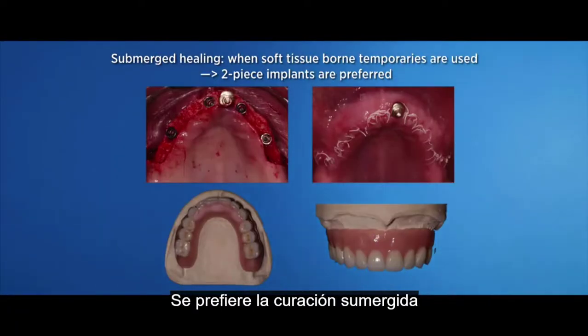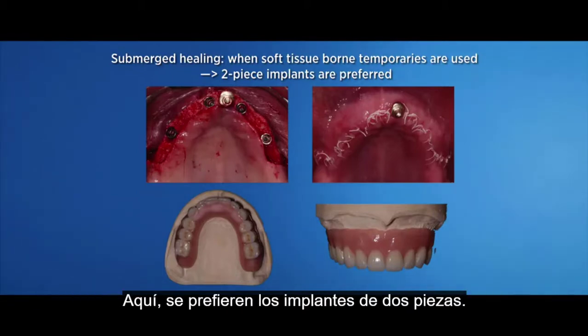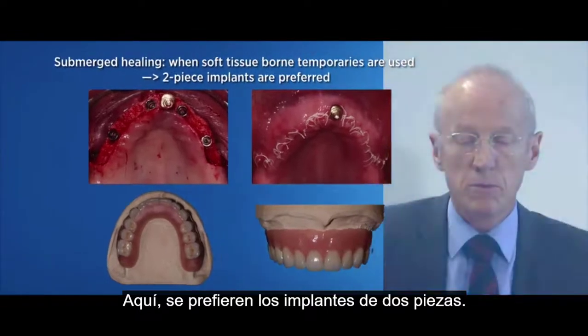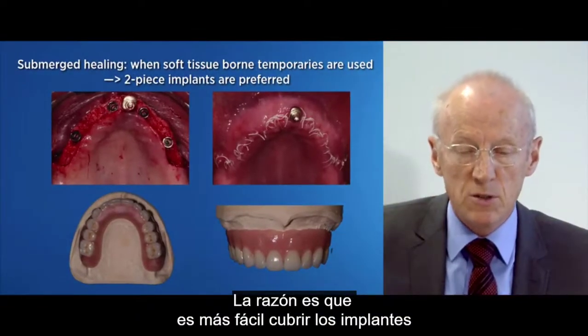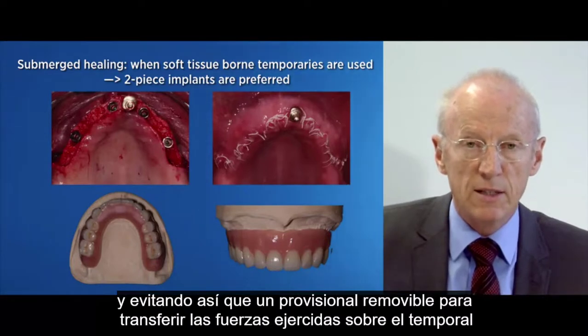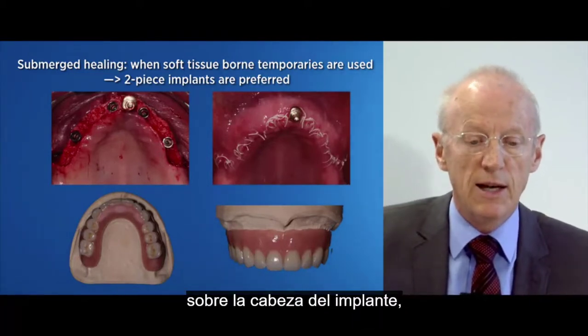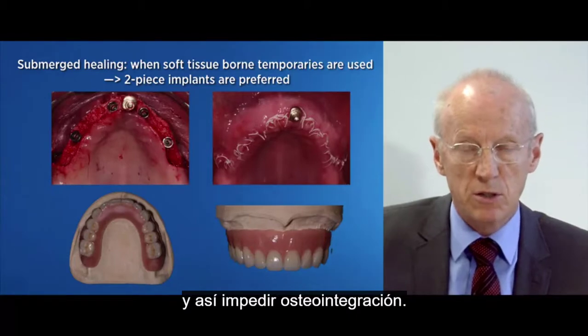Submerged healing is preferred when soft tissue-borne temporaries are used. Here, two-piece implants are preferred. The reason being, it's easier to cover the implants with the soft tissues and thus avoid the removable temporary transferring forces exerted onto the temporary onto the heads of the implant and thus preventing osseointegration from occurring.